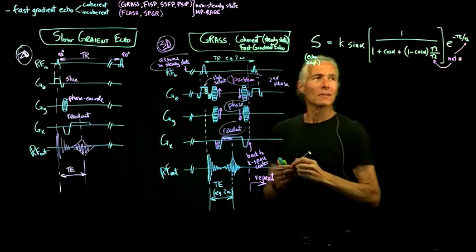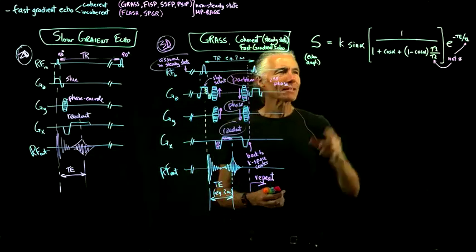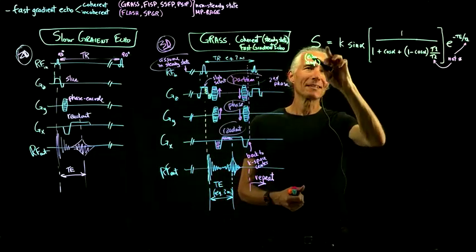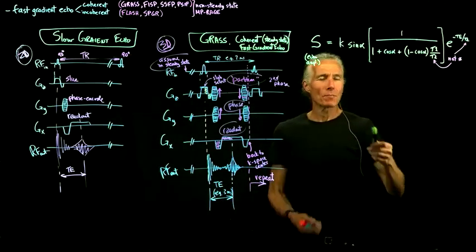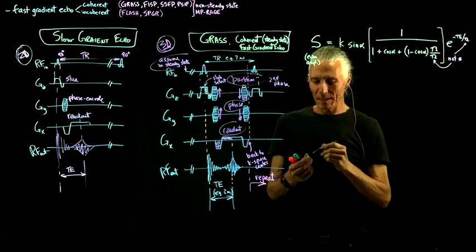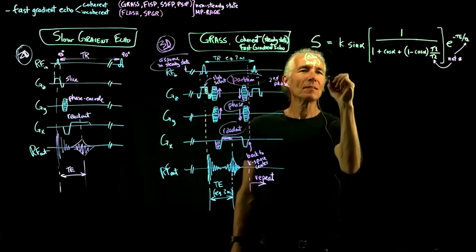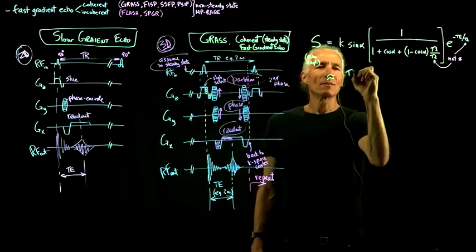So that looks like a mess, but how can we simplify this down? Say you've got the cosines and sines, let's just throw all those out. And so what do you have? You basically have 1 over T1 over T2. And so basically that's approximately equal to T2 over T1.